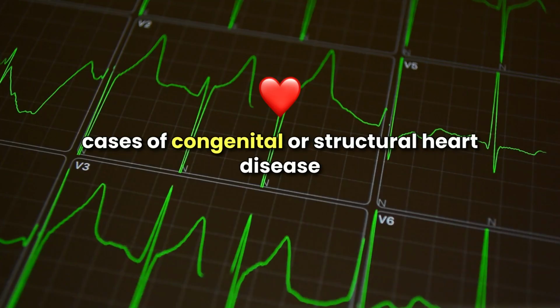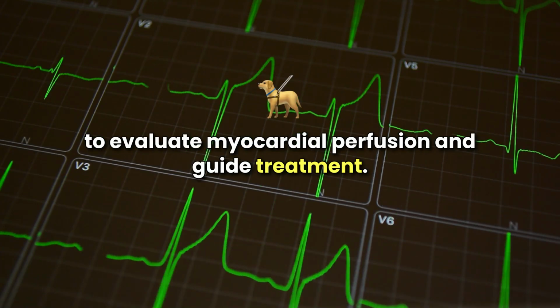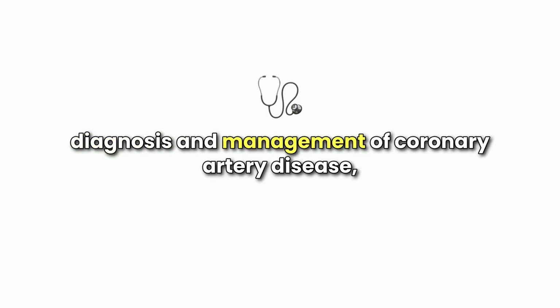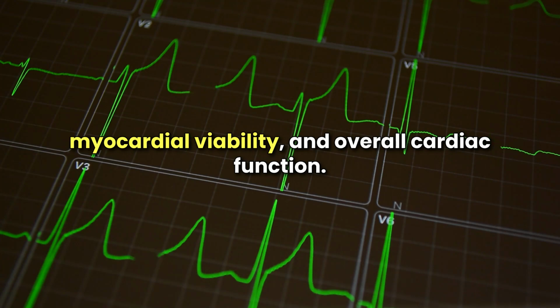SPECT MPI may be used in specific cases of congenital or structural heart disease to evaluate myocardial perfusion and guide treatment. SPECT MPI is a crucial diagnostic tool in cardiology, providing essential insights into the diagnosis and management of coronary artery disease, myocardial viability, and overall cardiac function.